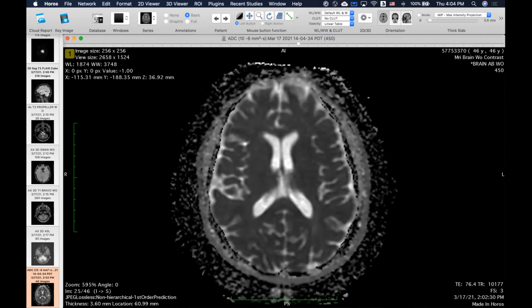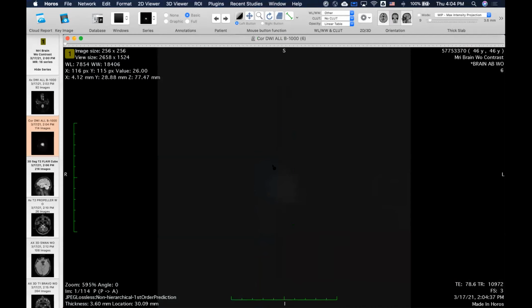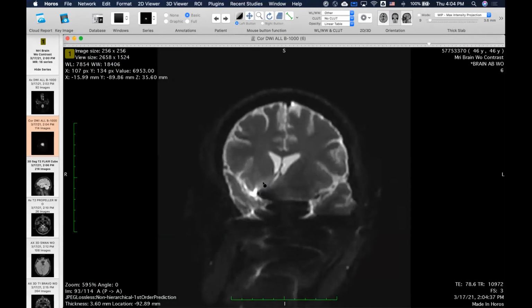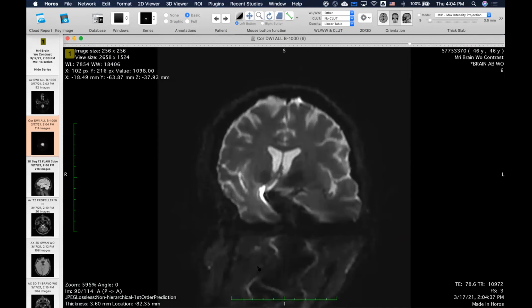I didn't show you the coronal diffusion, and I have to show you that because it's pretty cool. And the reason it's cool is because it is so corrupted. Look at how the brain is disrupted. Because of the geometry, different areas like my shoulders, there's an edge with respect to the main magnetic field that creates a big distortion of the magnetic field.